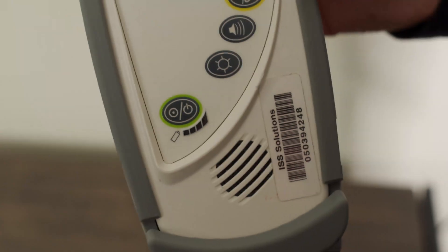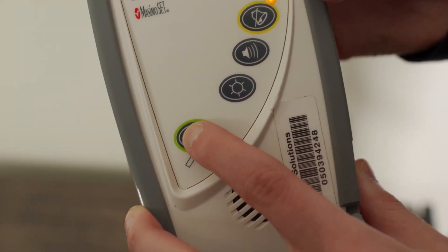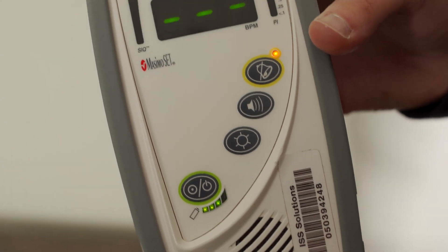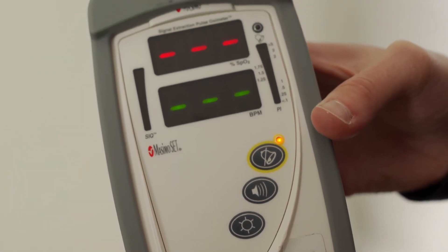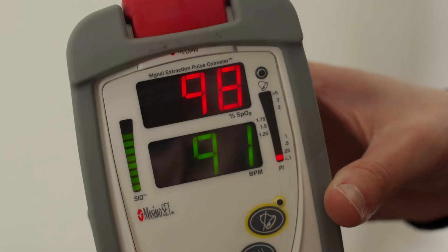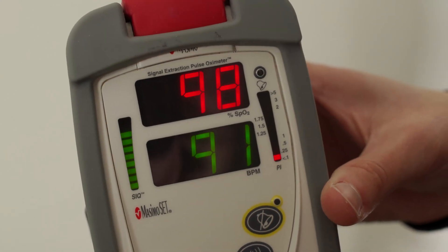Next, you'll turn on the equipment by pushing the button at the bottom. After a few moments, the numbers will appear. The number on the top is the percent SpO2, and the number on the bottom is the heart rate.